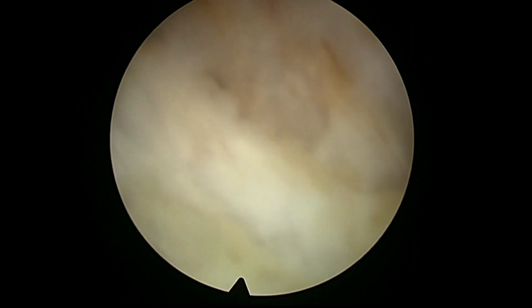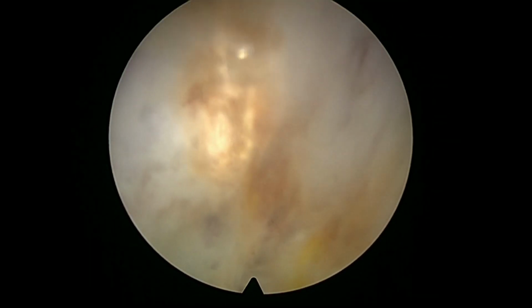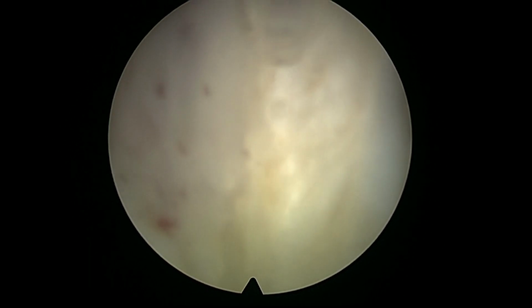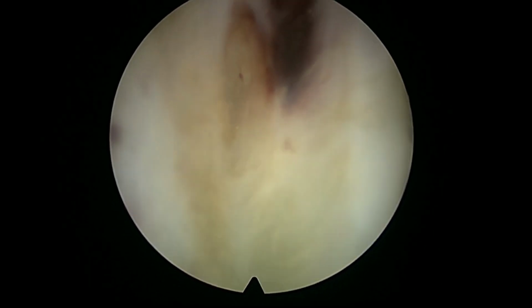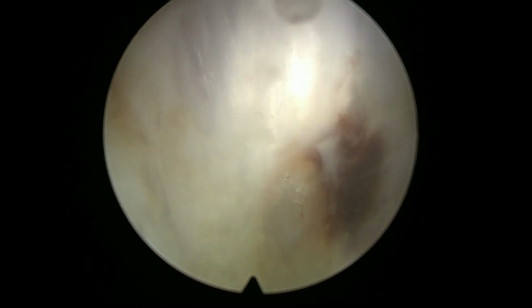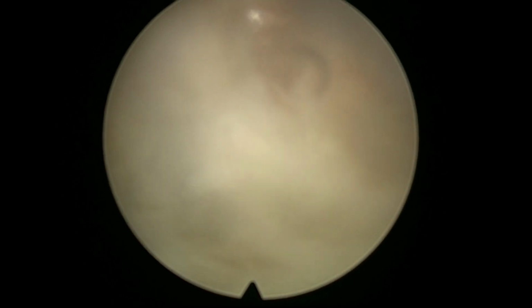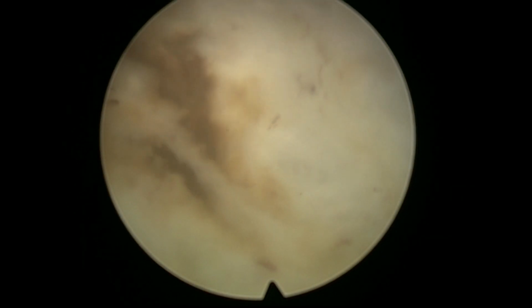Also, once you get comfortable with the laser, it becomes your instrument, the instrument you use for endoscopy, and you feel comfortable doing bladder tumors, you feel comfortable doing enucleation of all sorts of prostates. So really, I haven't found a case where I couldn't do this and I had to just do a classical channel TURP.